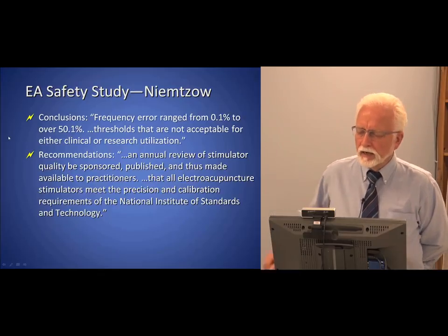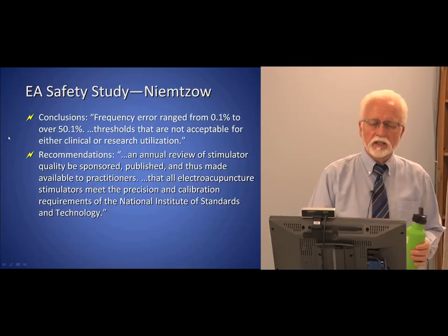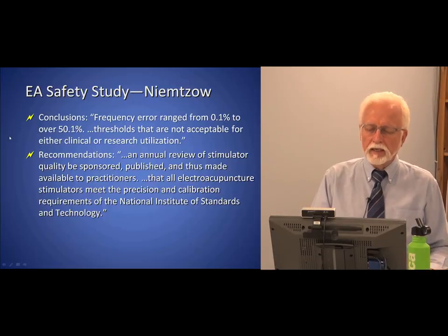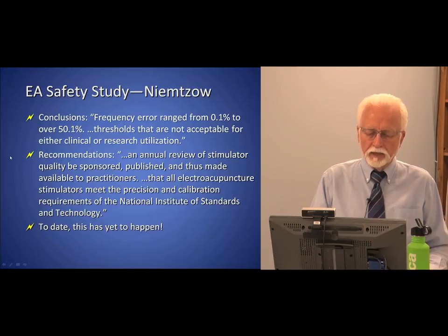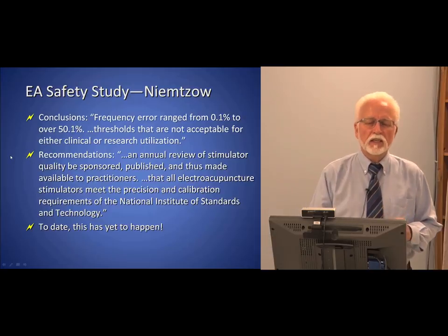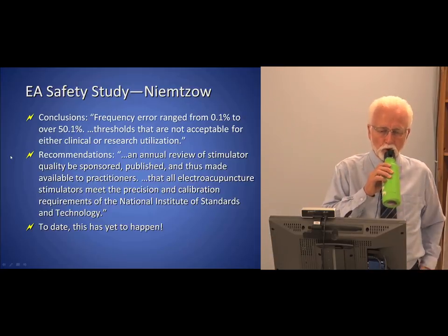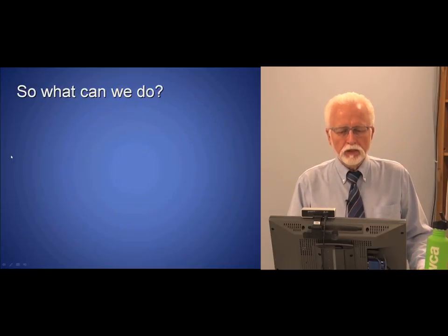Now, Niemzow was an Air Force colonel, MD, who did acupuncture. I think he's since retired, but he did have a lot of clout at the time he was making these statements. Unfortunately, though, nothing has happened. To date, there are no testing agencies involved in testing electroacupuncture devices. So what can we do?